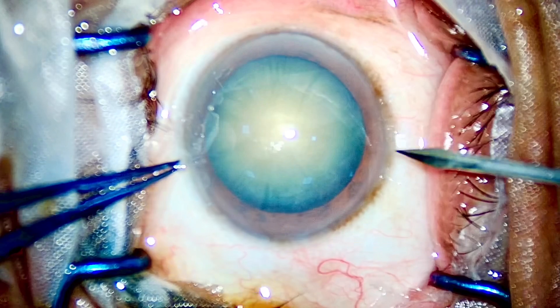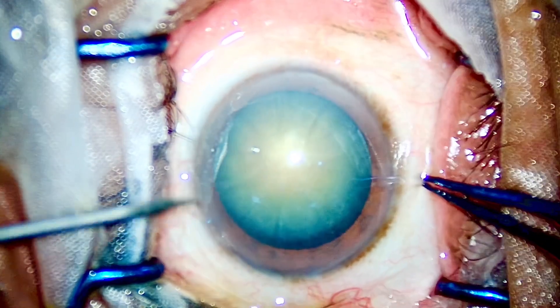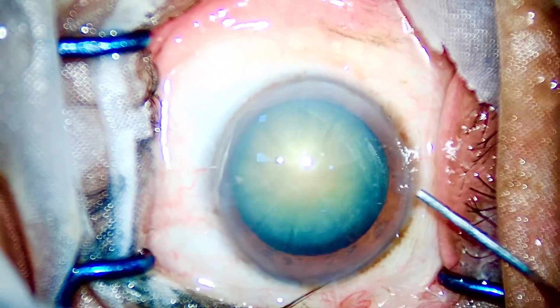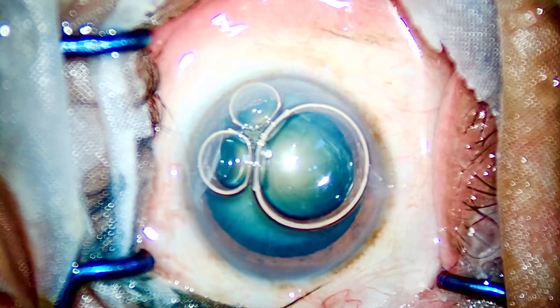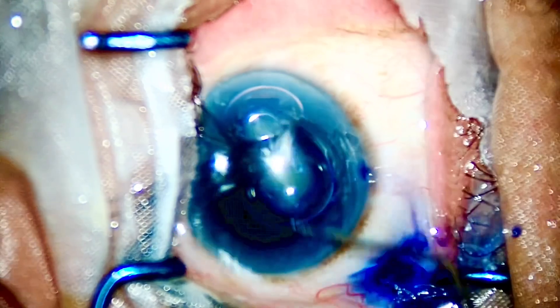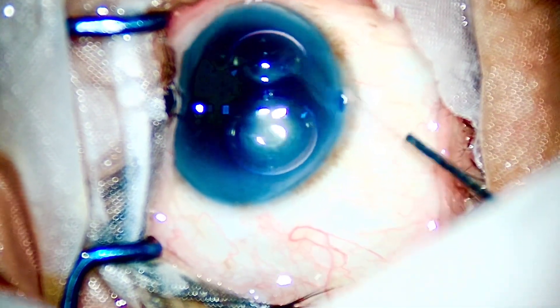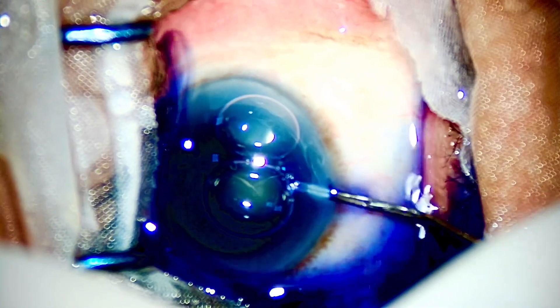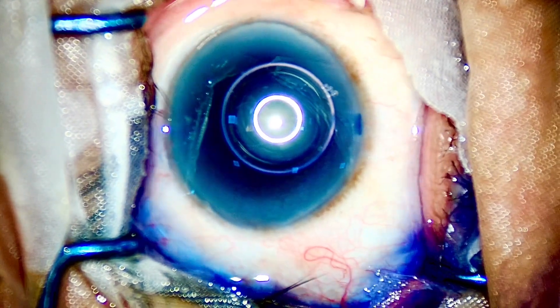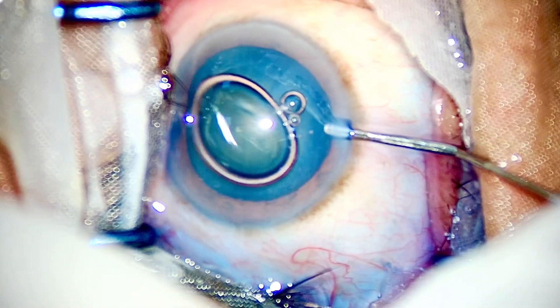Coming to the case — I'll demonstrate the importance of the bevel-down technique for a good vertical chop in this Grade 4 nucleus. This is a hard nucleus and we'll be going through the same steps: creating two side ports, injecting some air bubble, injecting some dye for staining the capsule. I'll be cleaning some fatty secretions from the lashes, washing away the dye, putting in some viscoelastic, and then going ahead with the capsulorrhexis. One point to note in all hard cases is to make an adequately sized rhexis.